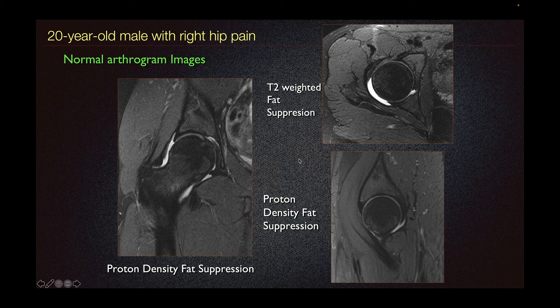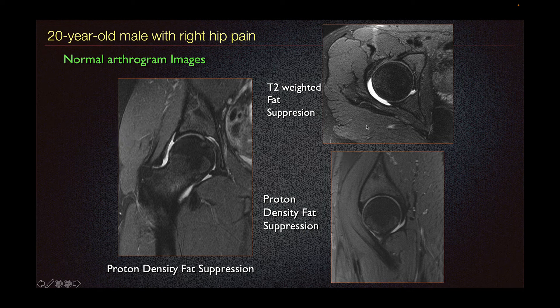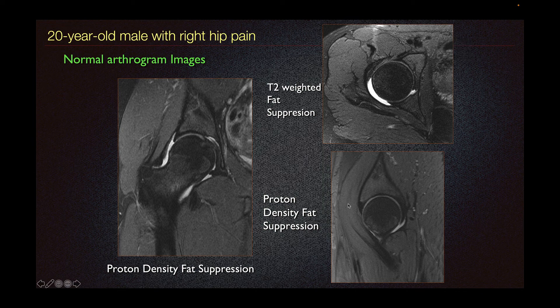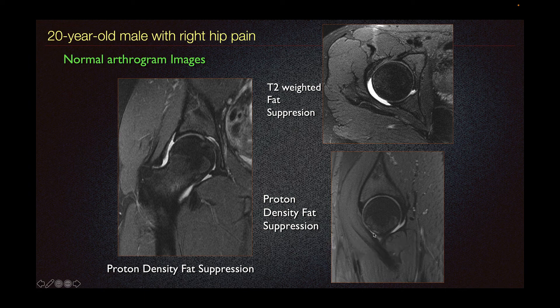When evaluating the labrum, we look at all the sequences and all the planes. To look at the superior labrum, it is best depicted on our coronal imaging showing this triangular hypointense band. In our axial imaging, we best see the anterior and posterior labrum on T2-weighted fat-suppressed imaging, whereas the anterior superior labrum is best seen on our sagittal imaging, such as proton-density fat-suppressed images.